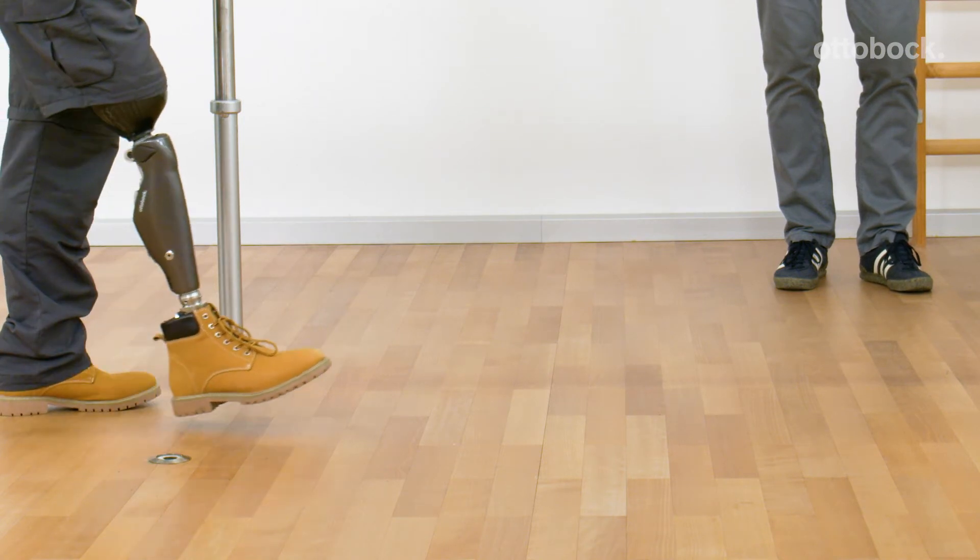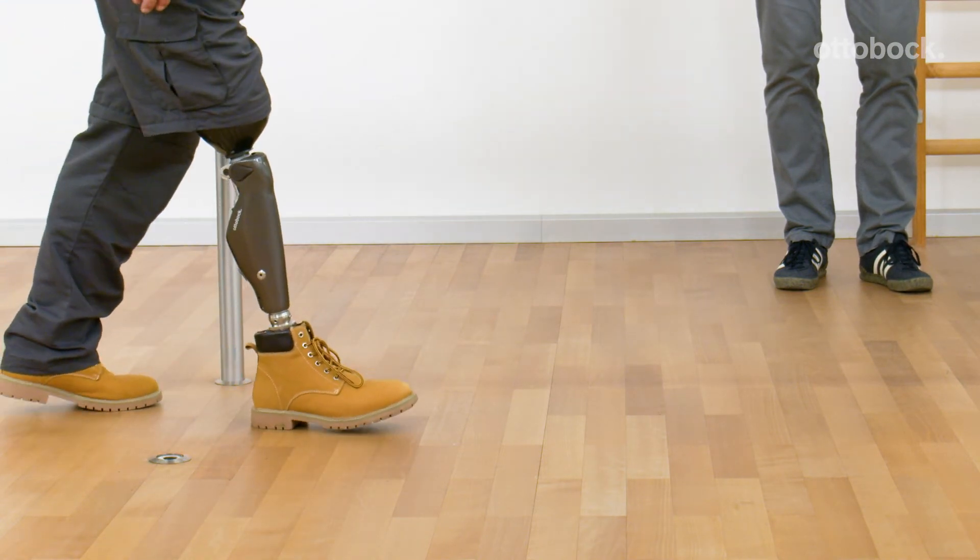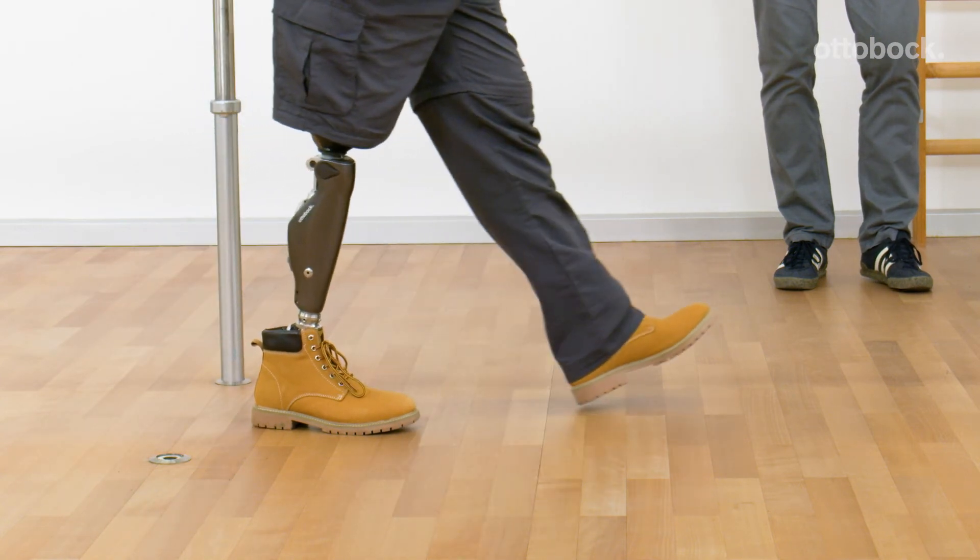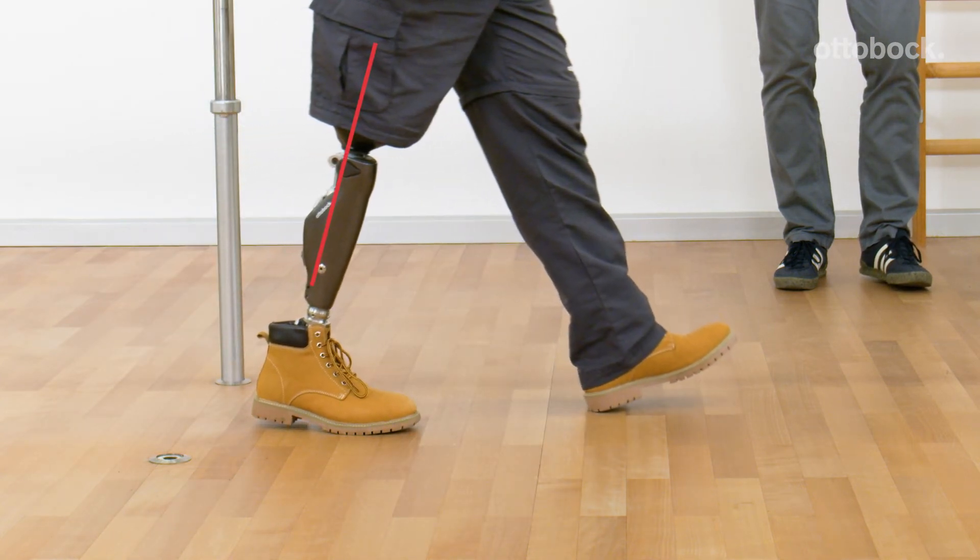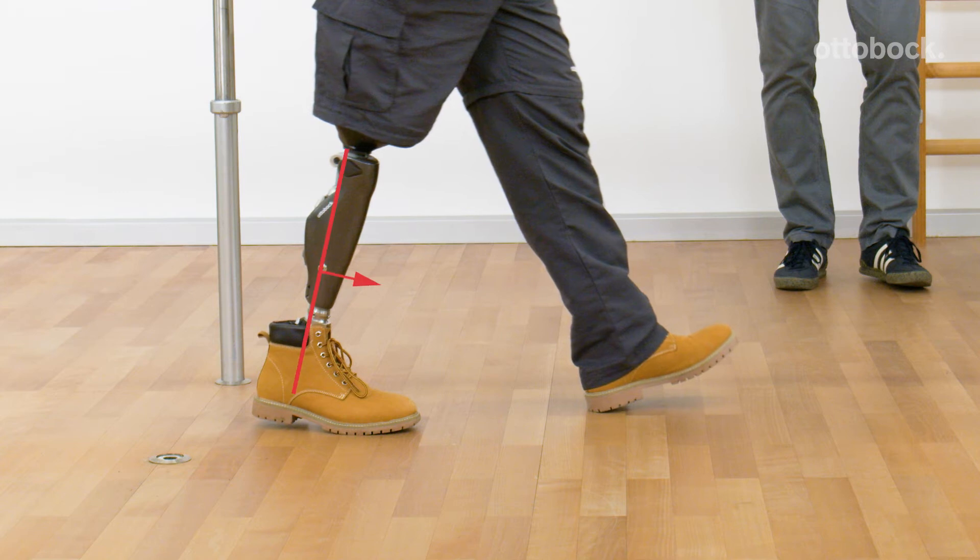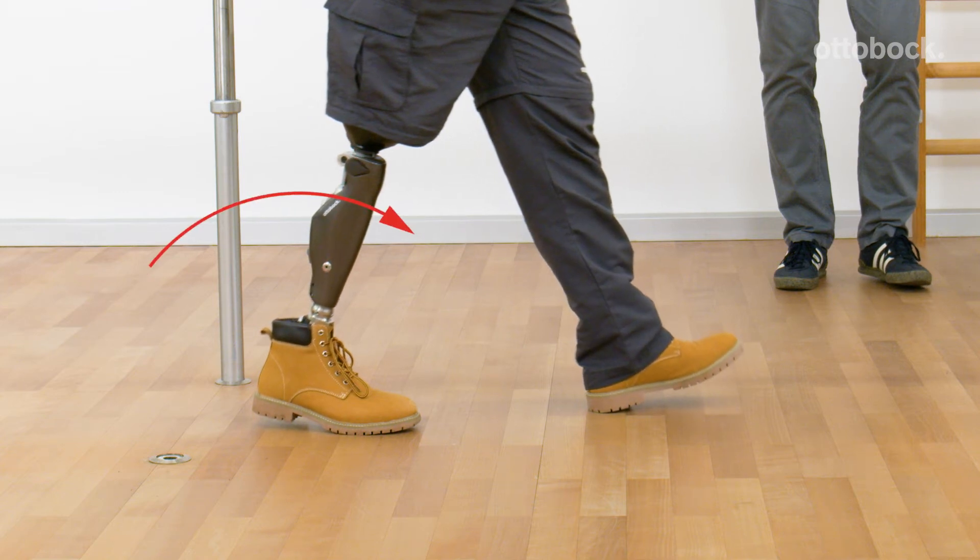As a reminder, the criteria for a stance release are: the knee joint is in extended position, the shank is tilted forward, and the shank is rotating forward.